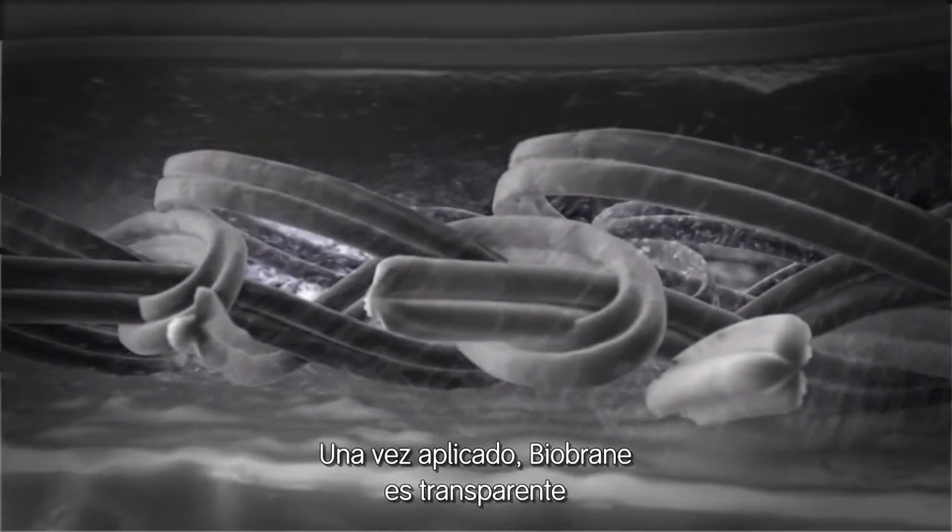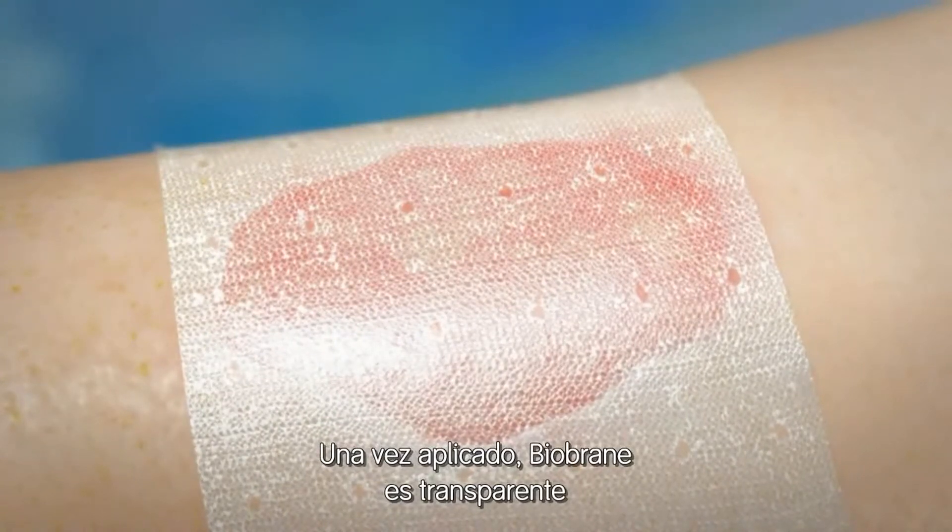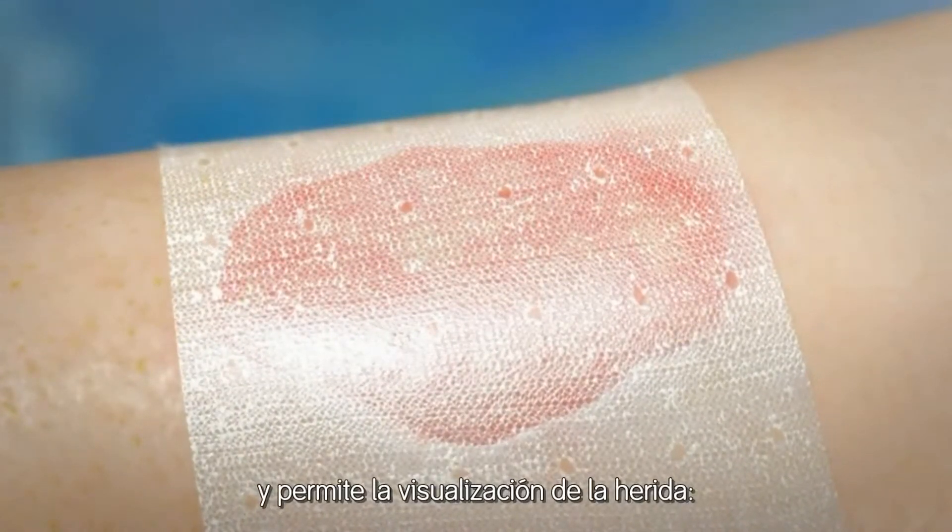When in place, Biobrane is also transparent, enabling visualization of the wound.